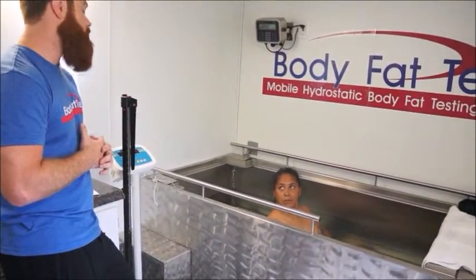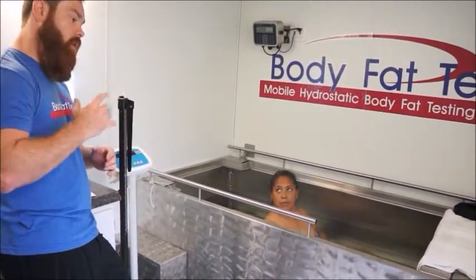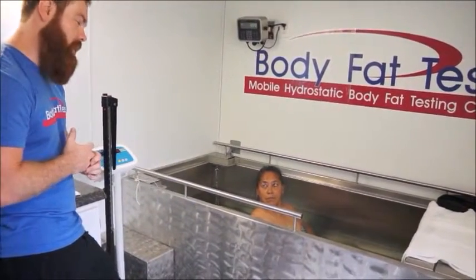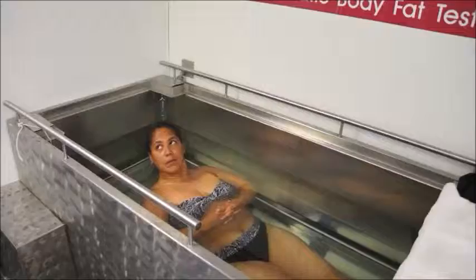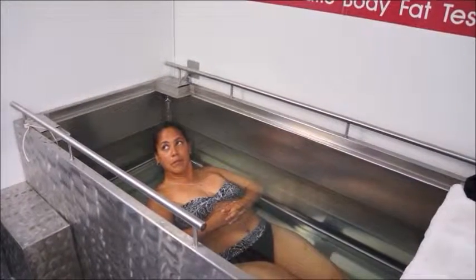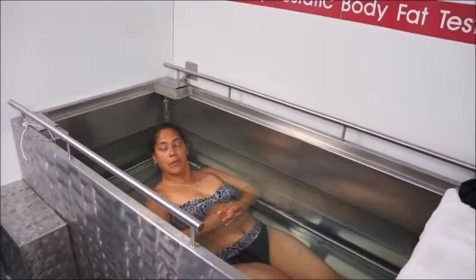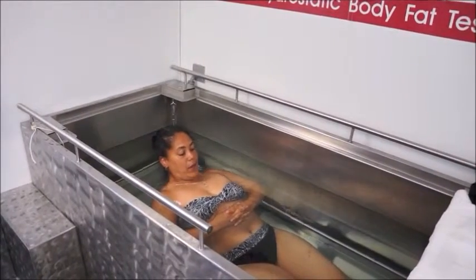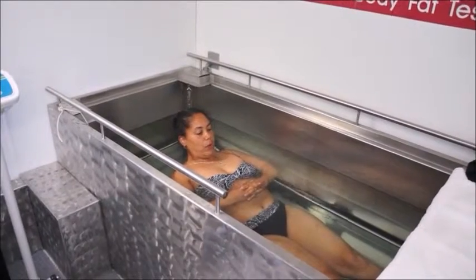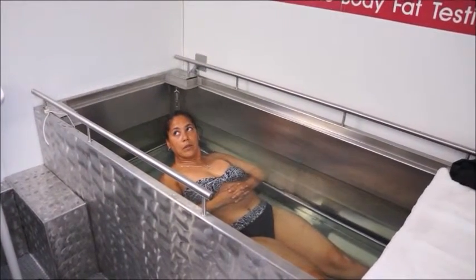What I'm going to have you do is submerge yourself while you blow out all your air. You're going to be underwater with no air for a few seconds — are you okay with that? Gently lower yourself under and blow the rest of your air out. Just stay down there and blow until you can't blow any more air out. The more air you get out, the lower your body fat percentage and the more accurate the test.